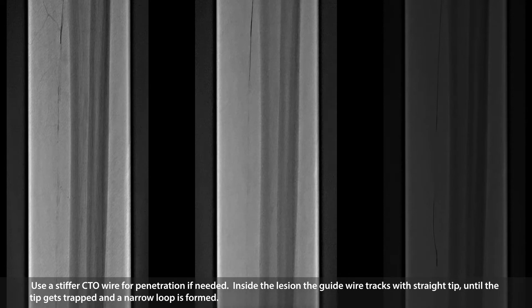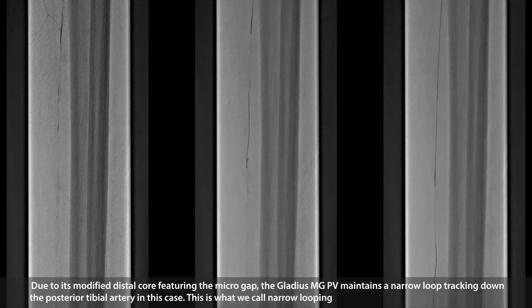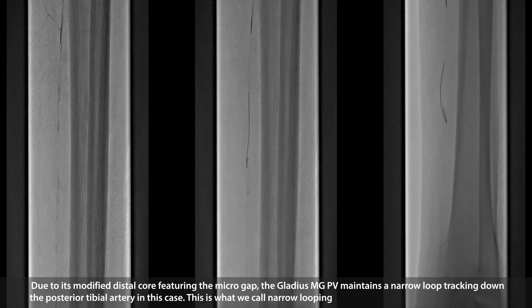Inside the lesion, the guide wire tracks with a straight tip until the tip gets trapped and a narrow loop is formed. Due to its modified distal core featuring a micro gap, the Gladius MG PV maintains a narrow loop tracking down the posterior tibial artery in this case. This is what we call narrow looping.